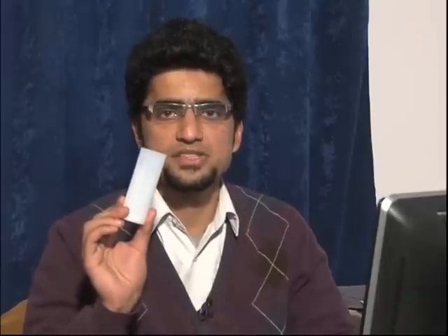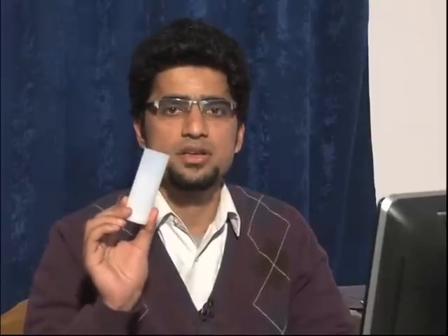This procedure is repeated 3 times on the patient and the best possible readings are taken. And after the usage of this transducer on one patient, it is advised not to be reused. This is how the whole spirometry is done. Thank you.